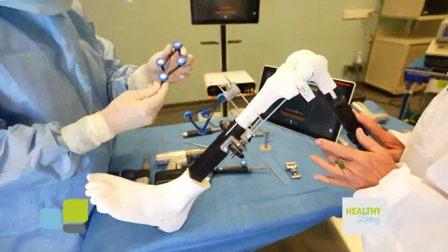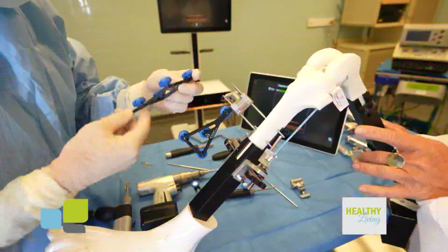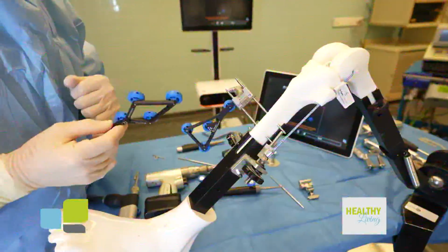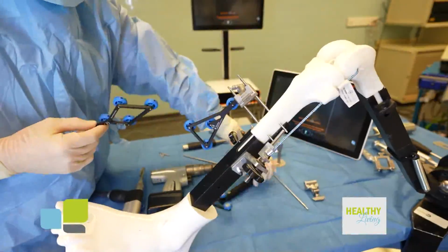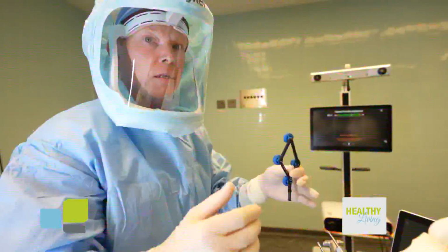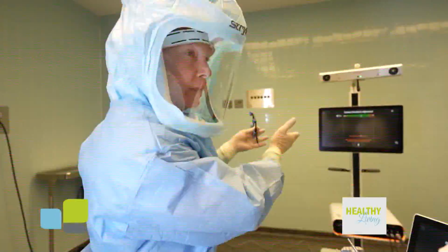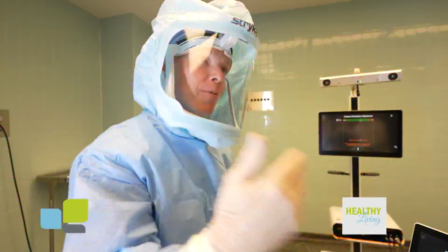And here's an example of the array that is not yet fashioned to the patient. This communicates with the robot, and the information that I give the robot with a special probe will then create an exact 3-dimensional replica that I can perform the surgery on virtually before I actually execute the surgery on the live patient.